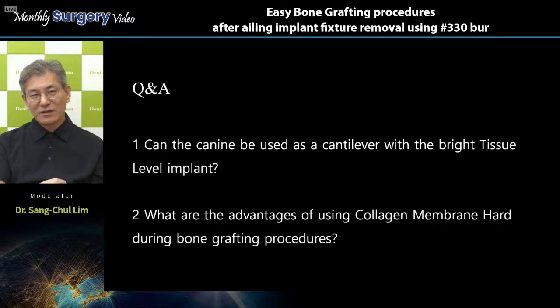However, the softer, resilient collagen membrane is suitable for a small defect. And also you can use it for a sausage technique or the same kind of technique. Generally speaking, the soft resorbable membrane has a faster resorption time, maybe 2 to 3 months.